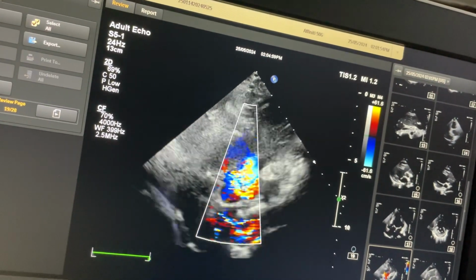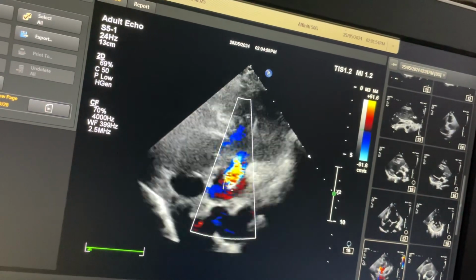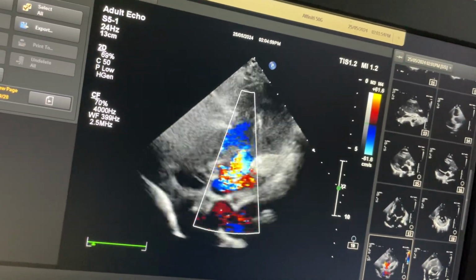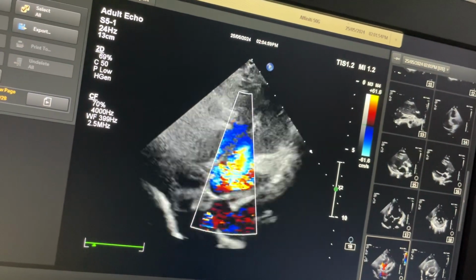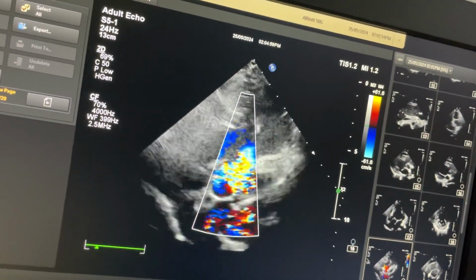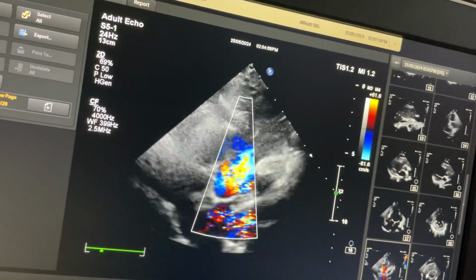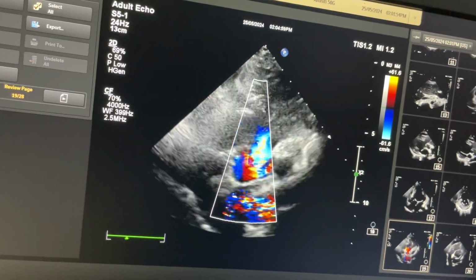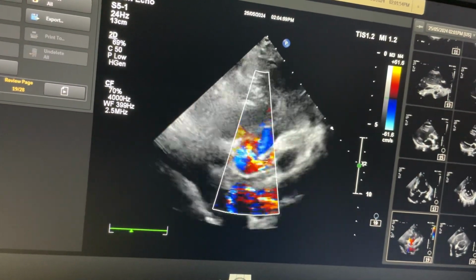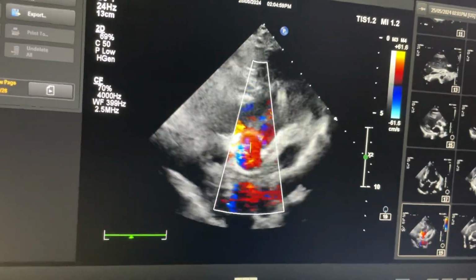So this case is double inlet single ventricle with pulmonary valve obstruction. That obstruction is an advantage for this patient. That is why the patient has survived up to the age of 35 years, and is still doing well in spite of this much congenital abnormality. So this case is double inlet single ventricle with detransposition with pulmonary stenosis, valvular stenosis. You can see the pulmonary valvular stenosis.